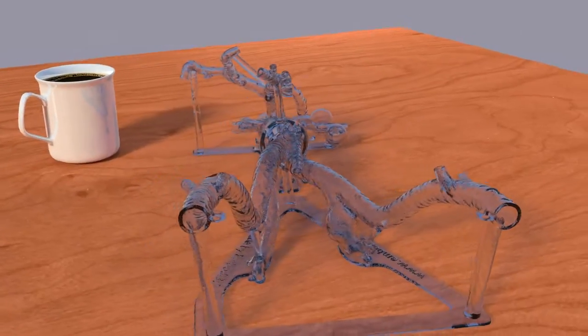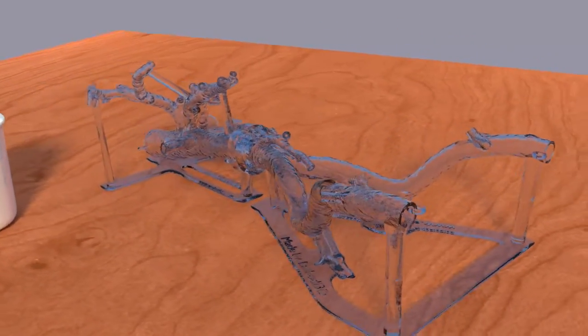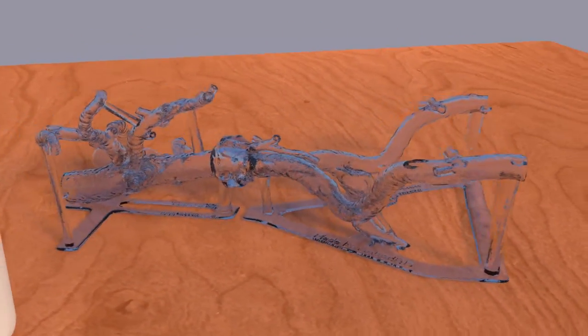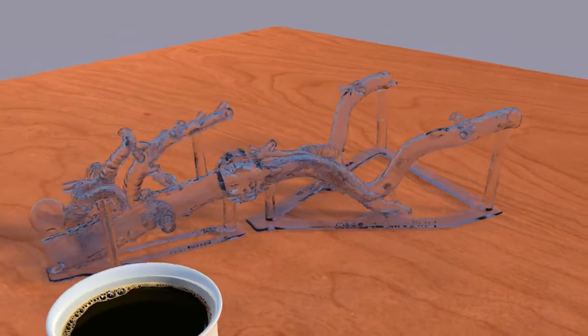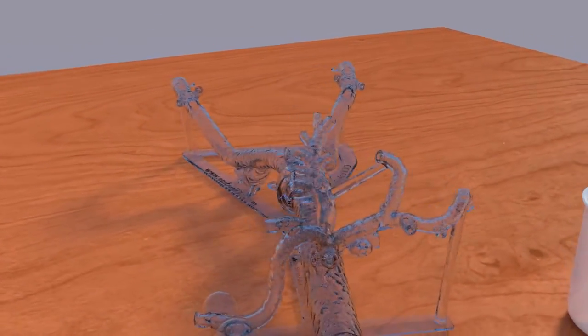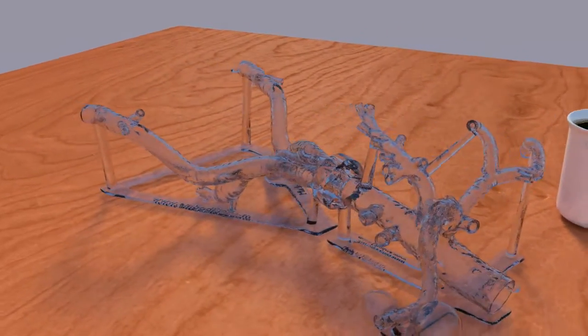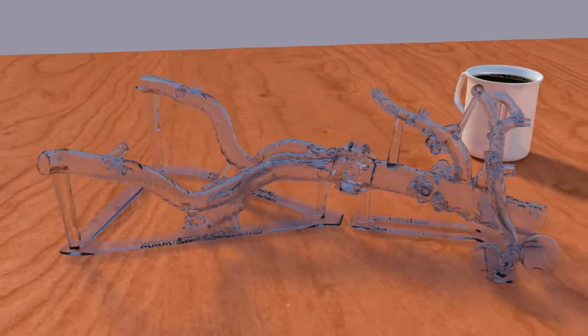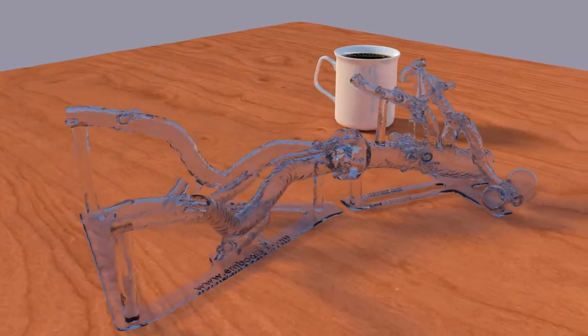The full aortoiliac model combines the benefits of the other two models. With complete arterial anatomy from the common femoral arteries at the hip to the diaphragm, a wide variety of abdominal and pelvic arterial interventions can be simulated realistically.